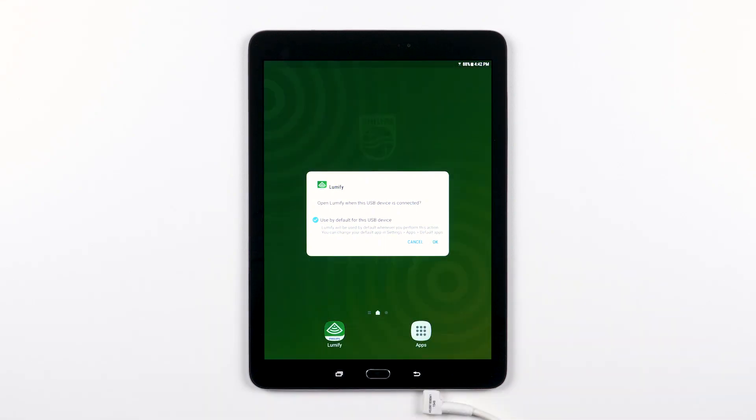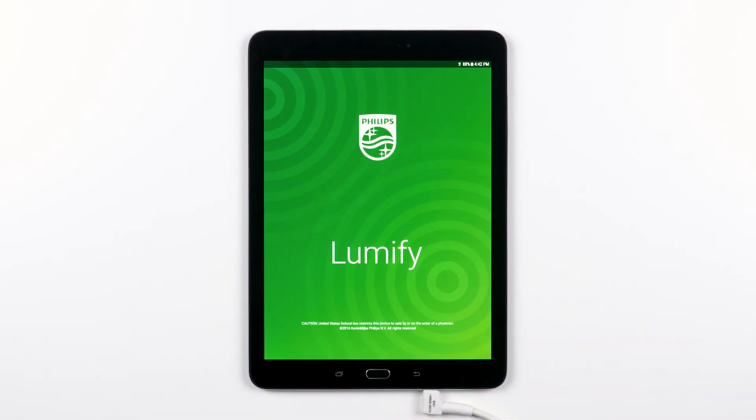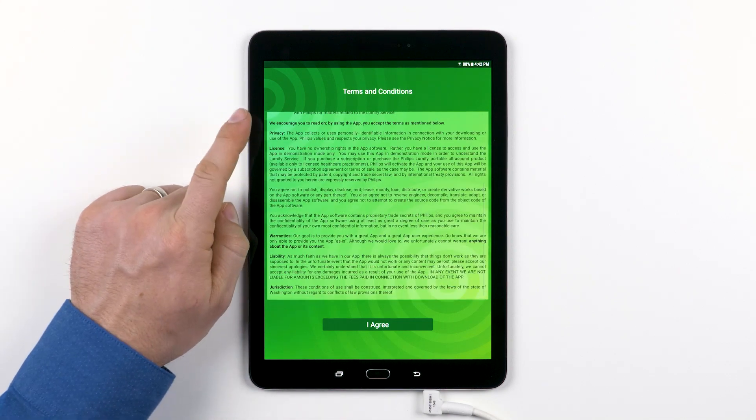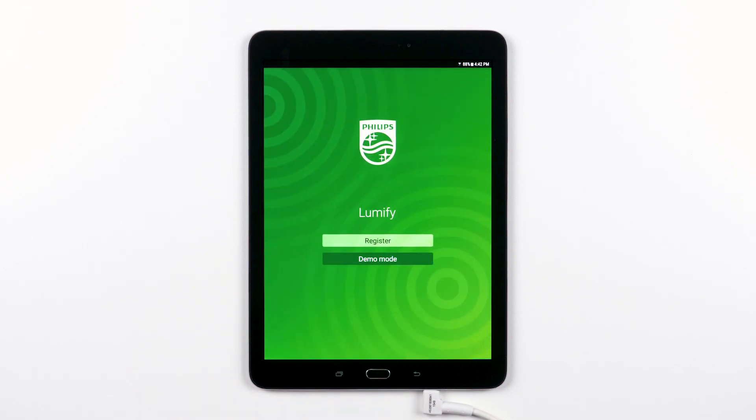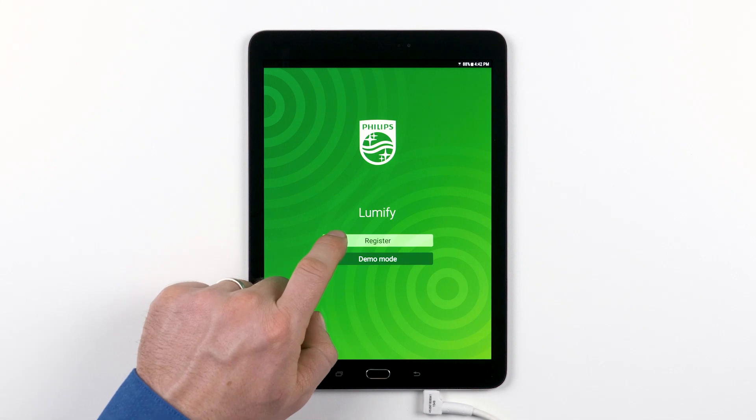Your Lumify app will begin to start up. There will be a few steps to registering your transducer when you first connect it to a new device. You will be presented with the Lumify app terms and conditions. Read through and tap "I Agree" to continue. Then, when you see the screen that gives you the option to tap Register or Demo mode, tap Register.